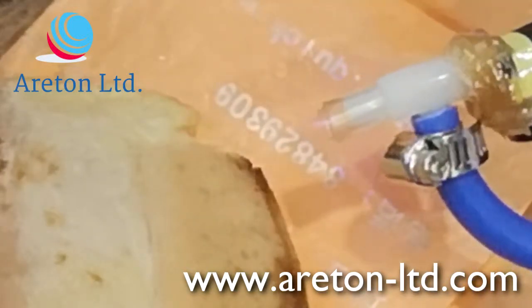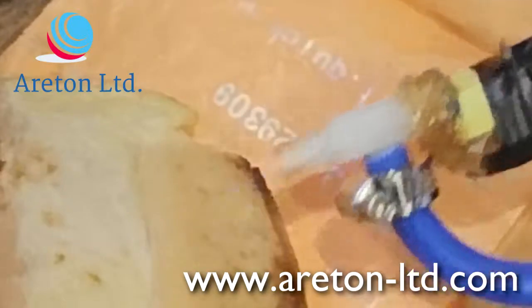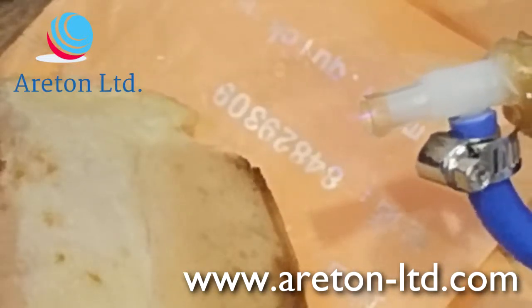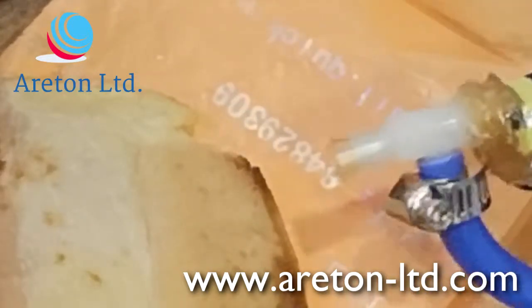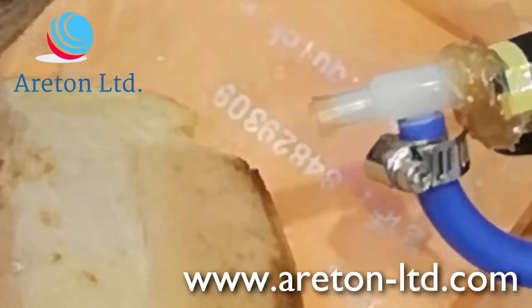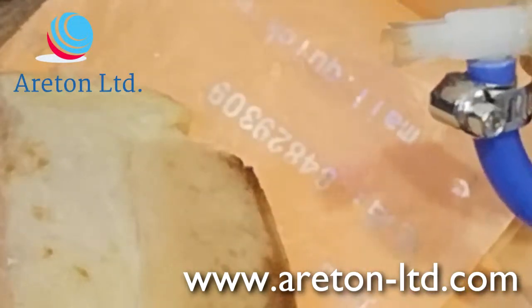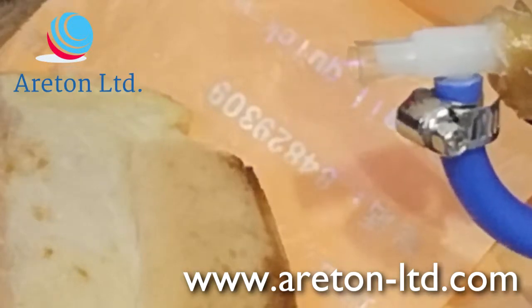I'm going to do it again, and it's off. I'm going to do it again, and it's off, because it's counting the overall 900 milliseconds time. So when you hear it beeping, it's actually detecting the arc. I'm going to do it again. It detects the arc. It's off. Now it's on. And it's off. Do it again. Okay, it hasn't detected it because you haven't heard the beeping. Now it's detecting it. So maybe the first 2 arcs were in the region of 400 milliseconds, the last one 100 milliseconds approximately. Just do it again.